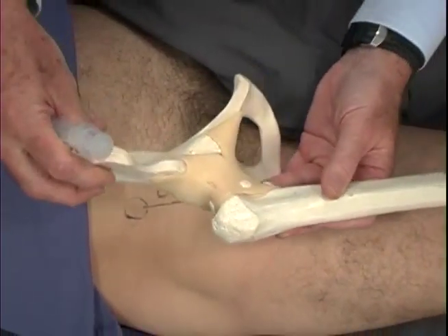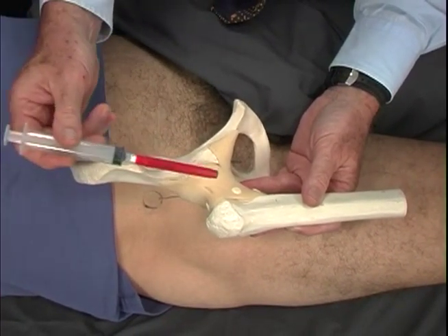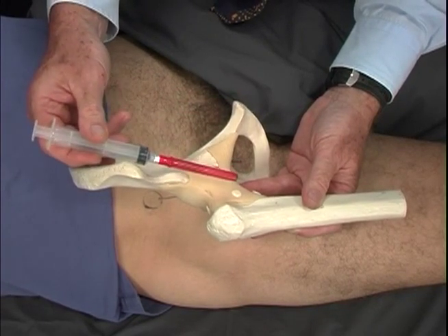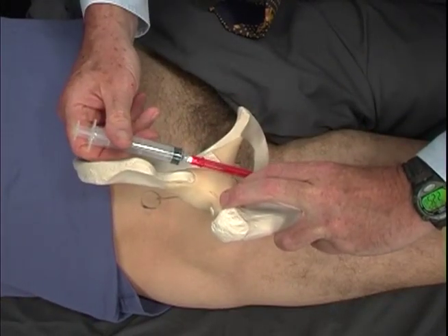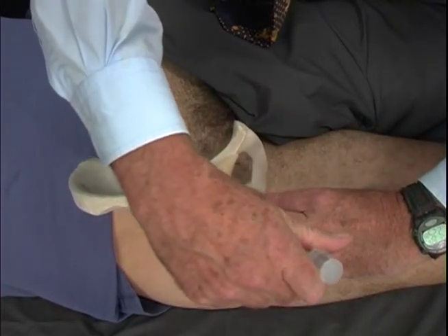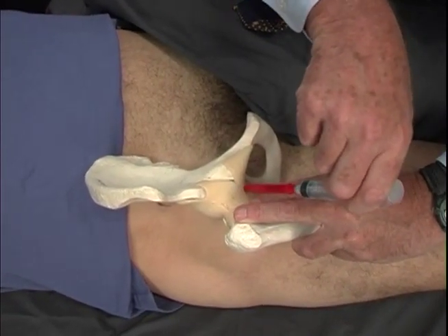If we orient ourselves on this model, we can see the ASIS here coming straight down in a line here and straight over in a line like this. We meet right here, and so our artery will be running right here, and our needle then will enter and slide in under the artery and coming into the capsular ligaments like so.